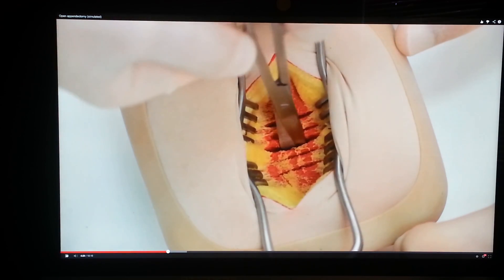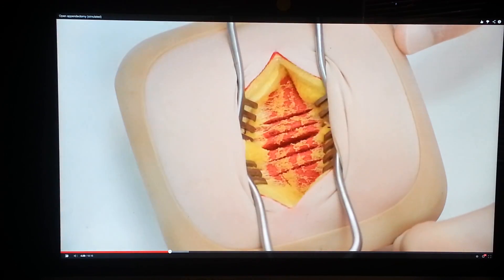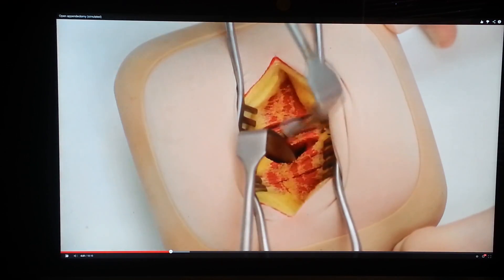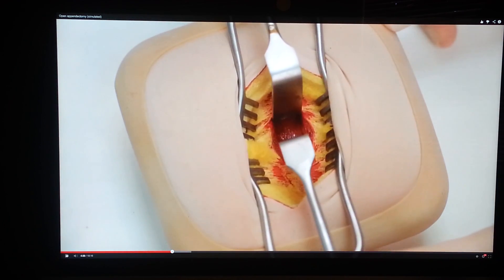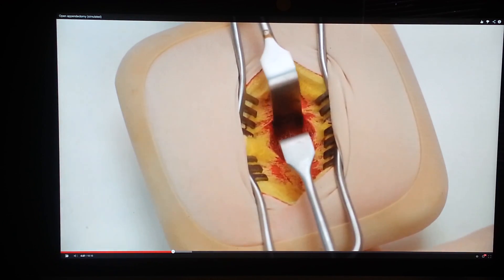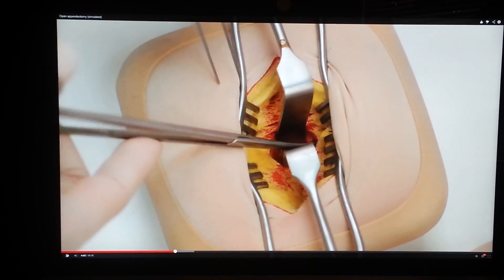We have purposefully scored this model to demonstrate the technique, although in the models with which you are presented, this will not be evident. The split can be widened using Langenbeck retractors to display the muscle underneath.